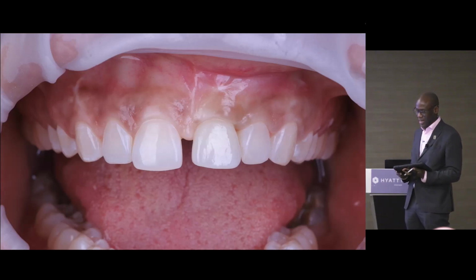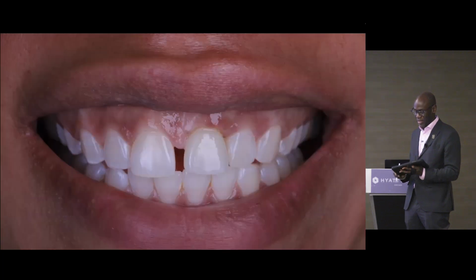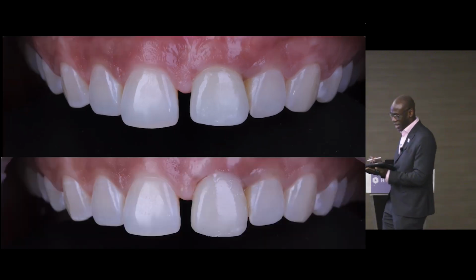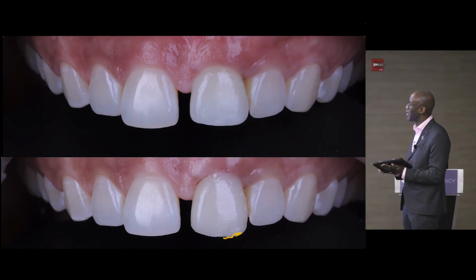at this, I'm thinking, I need that tooth a little bit taller. To me, in my eye, I think that this needs to come down there, and I'm communicating this to Steve. Steve, on the other hand, sees this ever so slightly differently. He looks at that, and he doesn't see that, because when he's looking at the computer, we're arguing and going back and forth, and this is me adding a little bit of composite and saying, this is how I want it. If you look closely, you'll see I've added a little bit there.